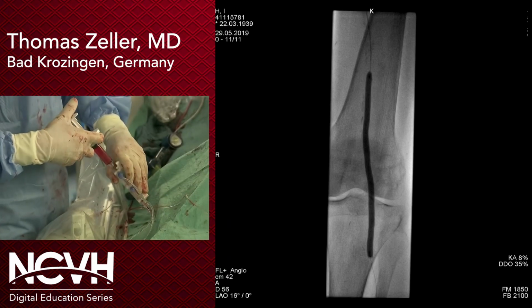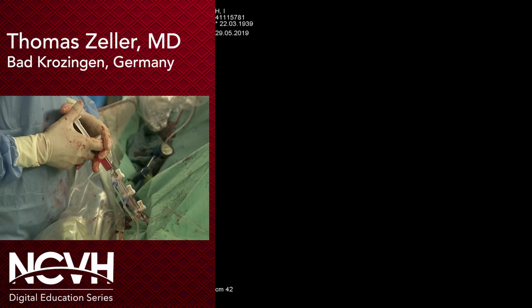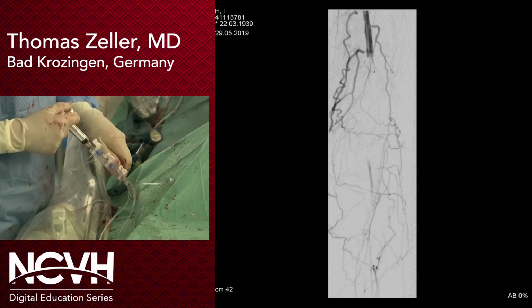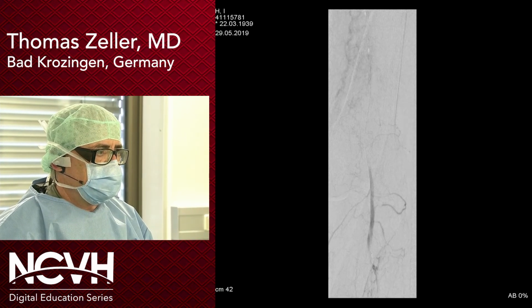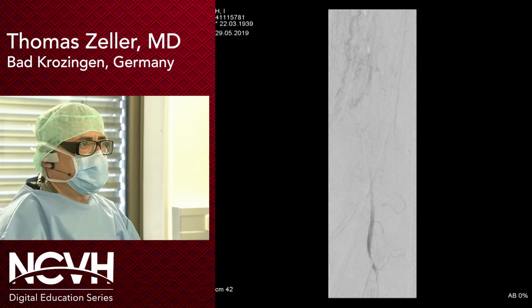And I will give you an interim angiogram after this angioplasty here. Oops. So what happened? Maybe I did squeeze some thrombus into the origin of the anterior tibial.